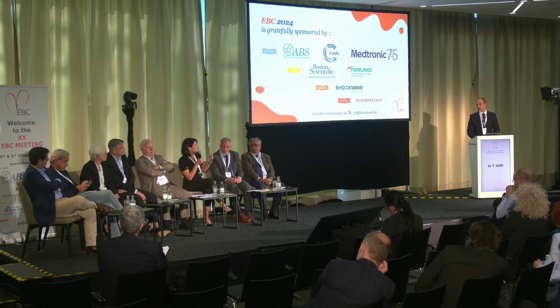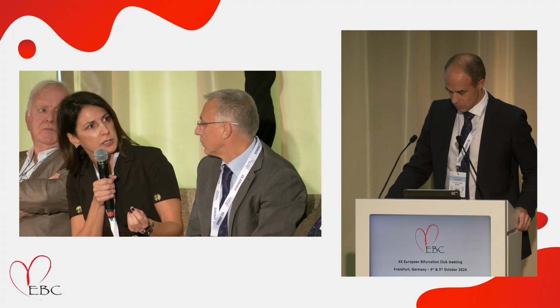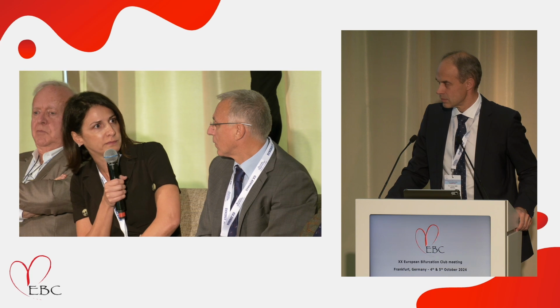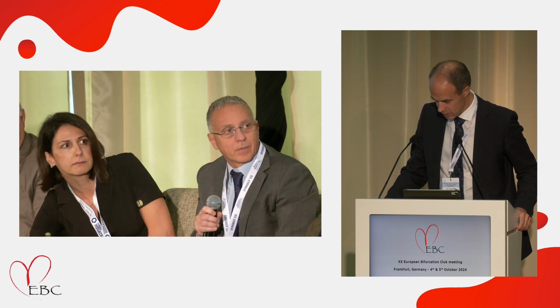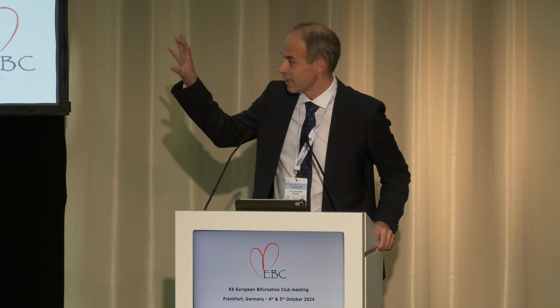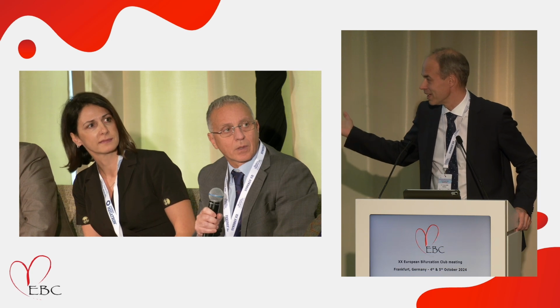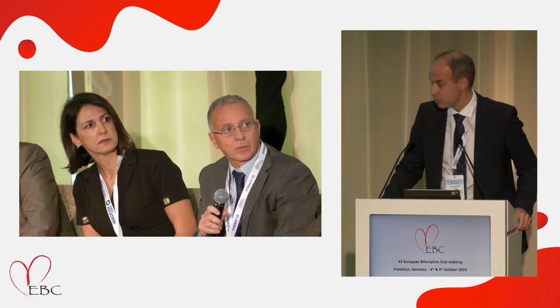Whether, if we don't do flaring, for example, I wanted to say, the flaring is also involved in DK crush technique as well, like optimization of the side branch ostium. Yeah, so absolutely agree with both comments. In terms of flaring, yes, it is very important. It wasn't in the guidelines for DK crush at that time, so therefore it wasn't done at that time, but absolutely, I totally agree with you that it's very important and it should be done.